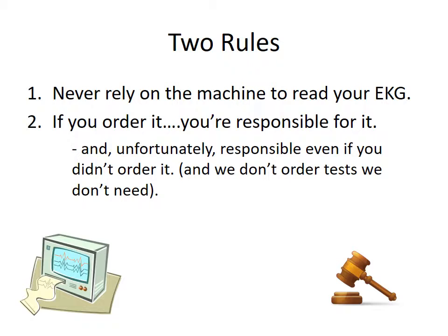Also, if you order an EKG, it's your responsibility. Even if you don't order it, and someone else ends up ordering it on your patient, or someone who's consulted on them, always make sure you review that EKG and make sure there's nothing abnormal that you need to take action on, because again, it will come back to get you later if there's something abnormal and it results in a poor outcome. That being said, let's move along and dive into this.